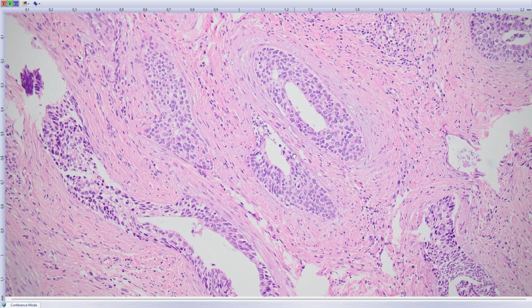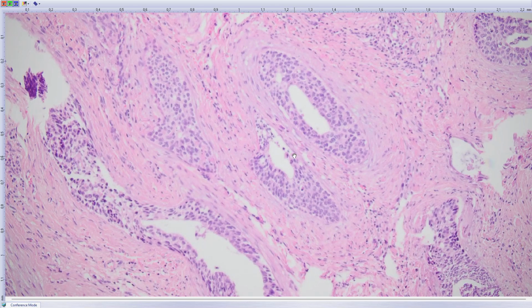We have cases in vulva and vagina which look similar to this but are entirely benign, even in squamous cell component and adenomatous components. I will show you one of these lesions next time. And we found in most of these lesions low-risk HPV, that means HPV-6 or HPV-11. So I interpret these lesions as low-risk HPV-driven benign adenosquamous polyps, or something like that. These lesions are not well entrenched in WHO classification.